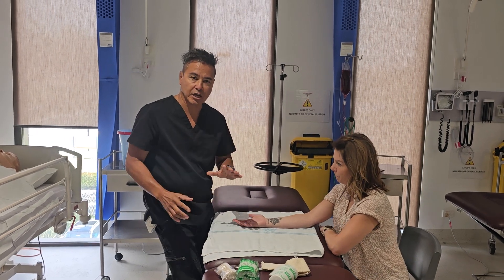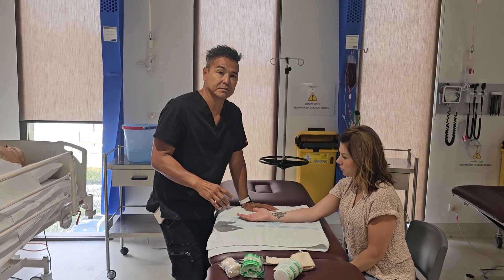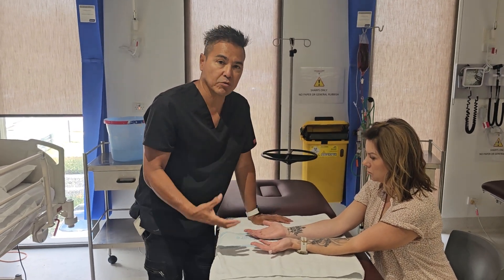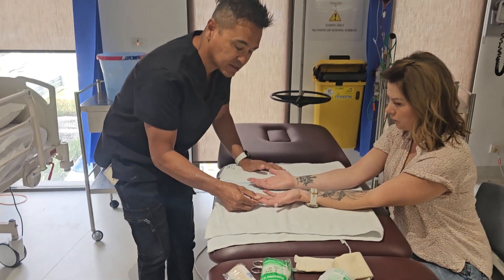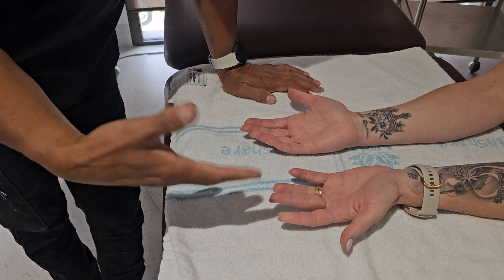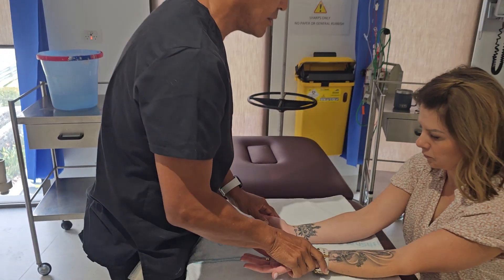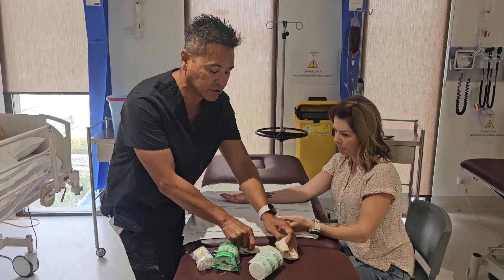Before we do a plastering, I like to do circulation observations on the limb. Whenever we do circulation observations on an affected limb, we do the normal limb first. So we count: one one-thousand, two one-thousand, three one-thousand — there's capillary return here. That gives us a bit of a baseline to work towards.